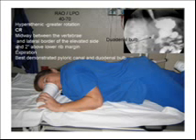Upper GI or stomach, right anterior oblique, 40 to 70 degrees. From a prone position, place the right arm down and the left arm flexed at the elbow up by the patient's head. Flex left knee for support. Rotate the body 40 to 70 degrees to place the right anterior body against the table. More rotation for hypersthenic body habitus and less for asthenic body habitus.